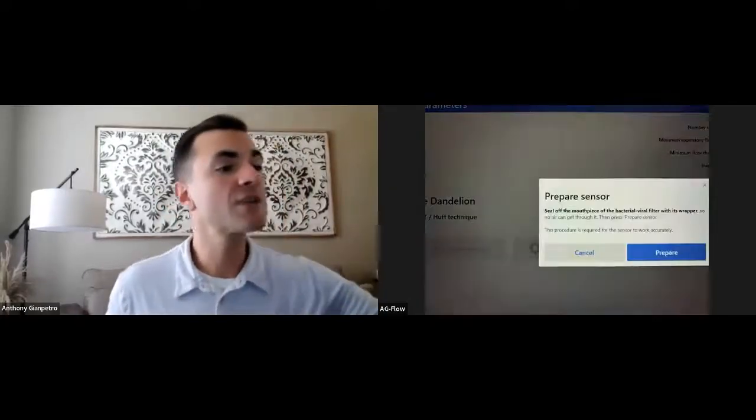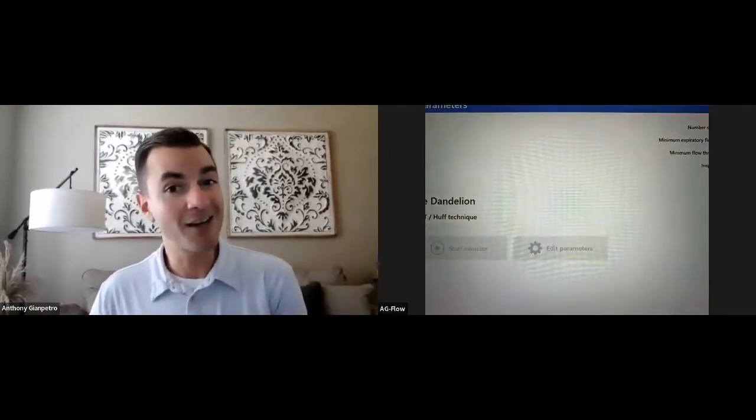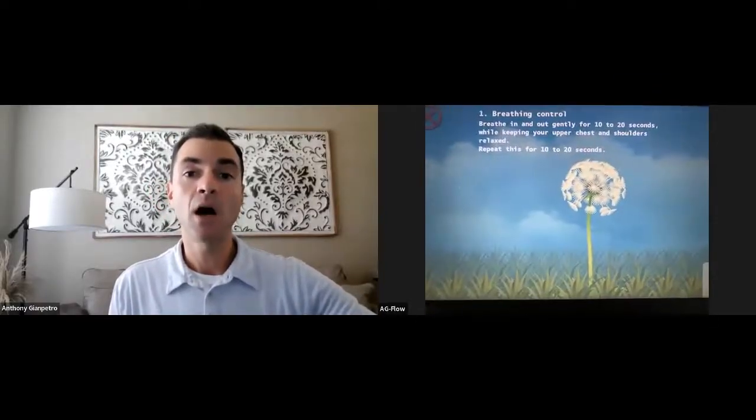Okay, we're going to start the exercise. We're going to prepare our sensor. I'm getting that little collection cup, right? I'm making sure I have all the tools that I need and that the patient is postured the way I would want them to be. And I'll back this up so you can see the whole screen. There we go. All right, and you'll notice, I might have to go over just a little bit more.